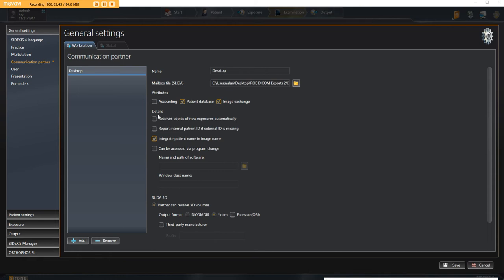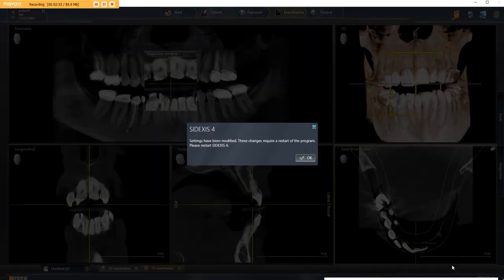Now what I didn't tell you was the first thing you'll do is click add down here, and that will open up all the windows, and you'll add a new communication partner. Click save, and there you go.